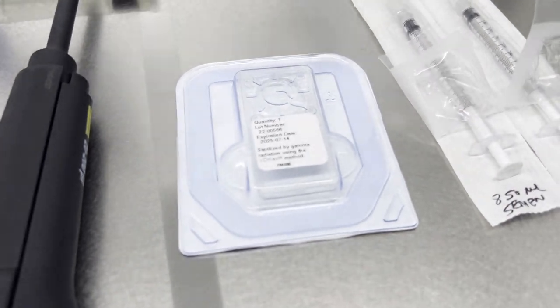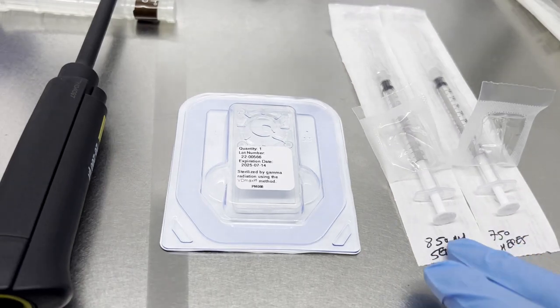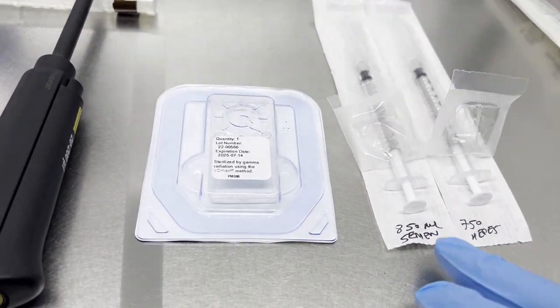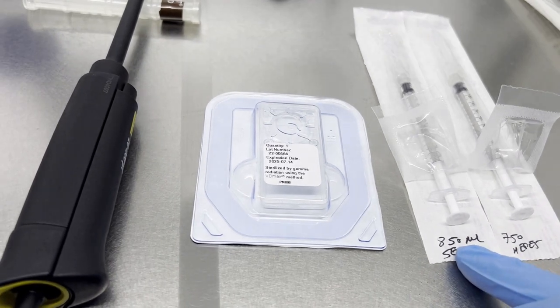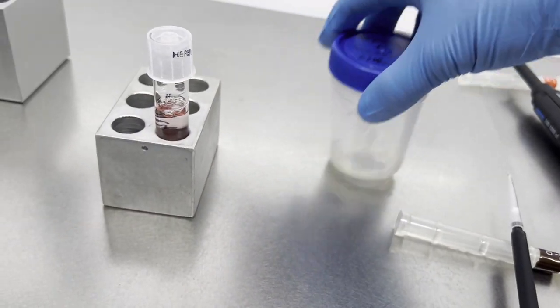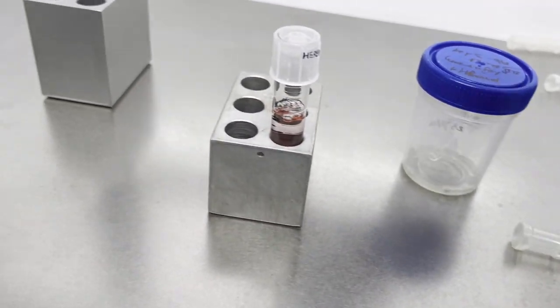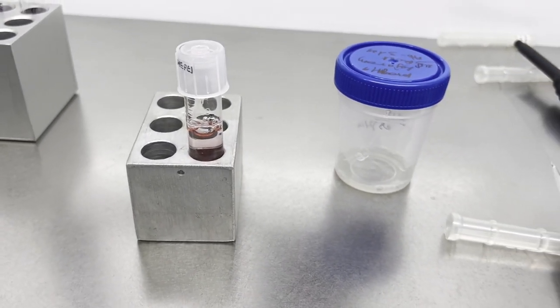So let's see how we can do it. For using the Xymote for semen preparation, we need two BD syringes — one for the semen sample and one for HEPES. We are going to use 850 microliters of semen sample and 750 microliters of HEPES. We should have a well-liquefied semen sample, and we are going to use this sperm washing media.